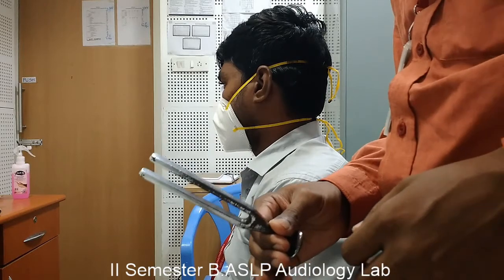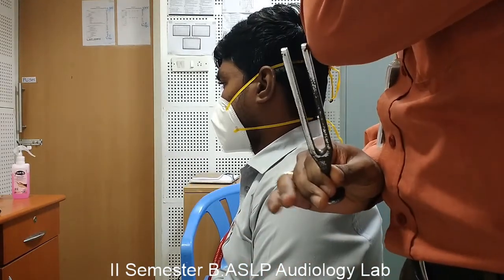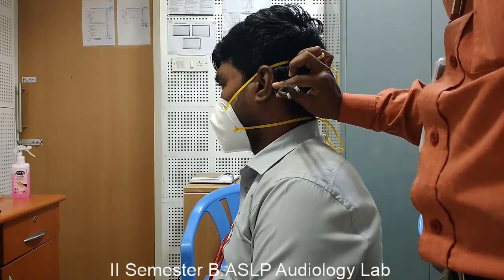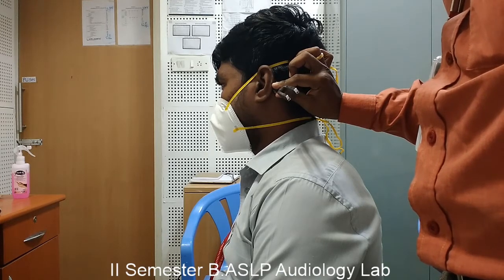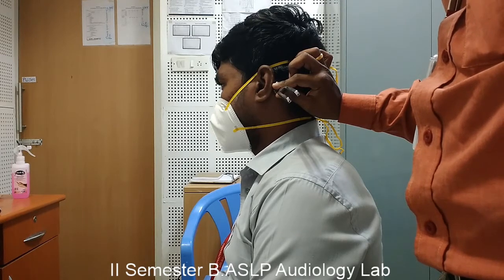The tuning fork has to be excited by striking the tips of the prongs on the elbow, and the base of the tuning fork is placed against the mastoid process. Now the subject will be hearing the sound through bone conduction mode. We need to wait till the subject stops hearing the sound through bone conduction.